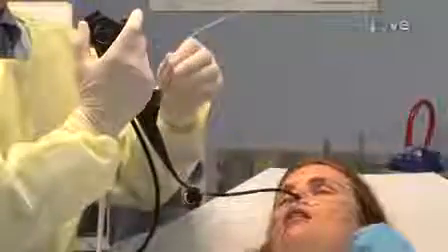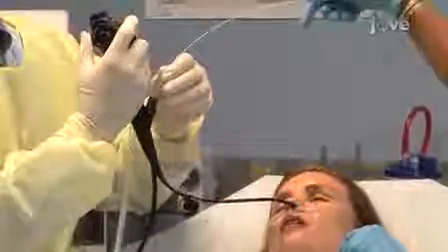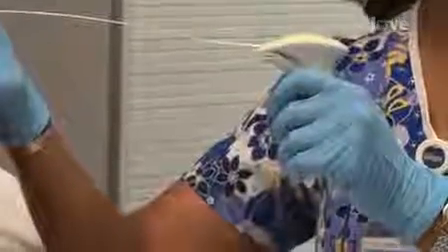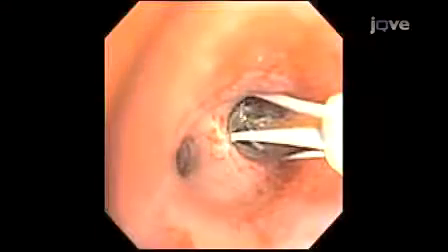Once the site is selected, the Alair catheter is introduced through the working channel of the bronchoscope and positioned at the desired location in the airway. At the proper site, the electrode array at the tip of the catheter is expanded under direct visualization to contact the airway wall. The bronchoscopist activates the radiofrequency controller by stepping on the foot switch to deliver RF energy to the tissue under direct visualization.